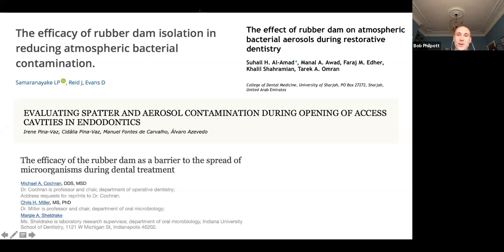And it's a good question because, I always compare it to when football managers are complaining about bad decisions for penalties and stuff, and they say, oh, I'm sure it'll even out over the course of a season. And it does. Some core buildups I'm really fast with. Restorations are easy to take out, very quick to build up. Some aren't, and they take me ages, and I just have to take that hit, as it were, and say, look, this is taking longer than I thought. I wouldn't ever take a core out, rebuild, and not access or do partial access at a visit.